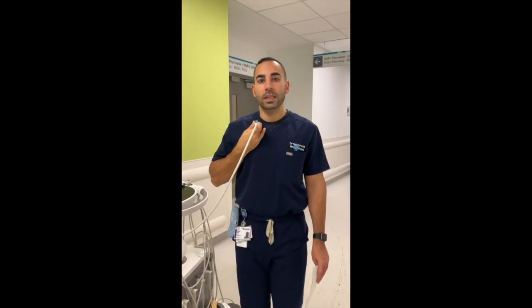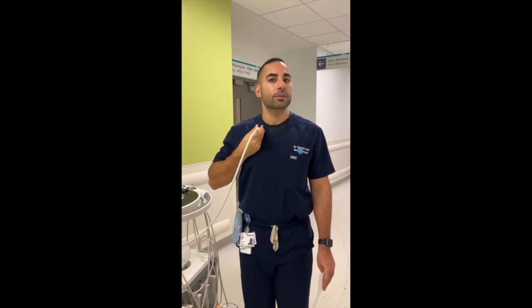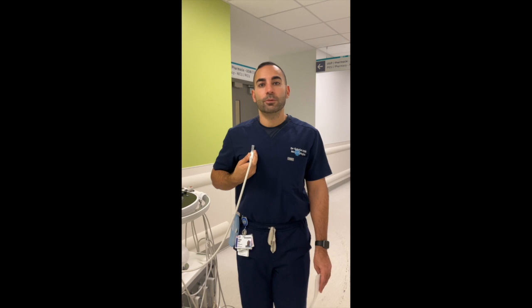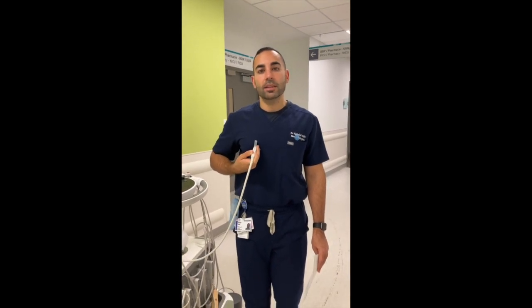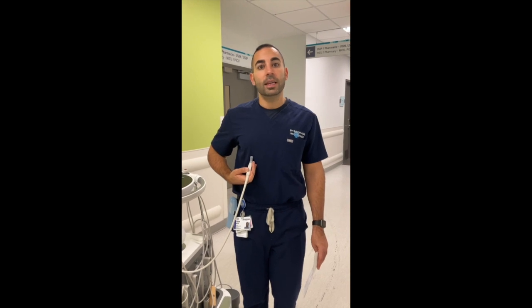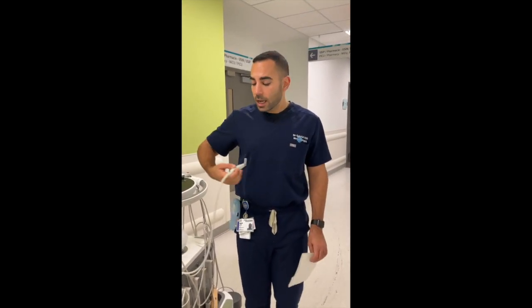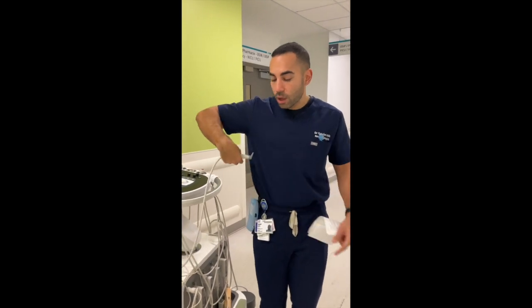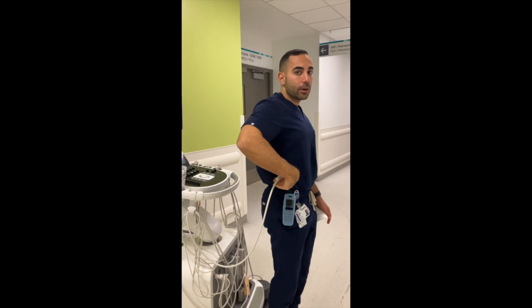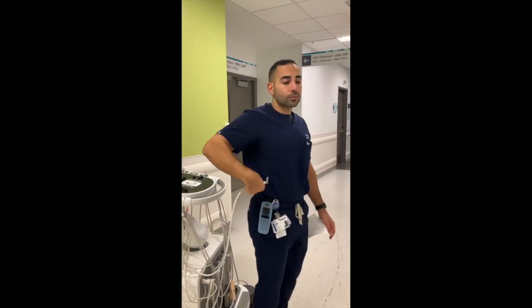When opening the actual images, you can start from the mid-clavicular line and drift down up to the nipple line. For the lower chest, you want to start at the nipple line and drift down up to the costal margin, where we see the diaphragmatic surface or interface with the lung. For the last view, the lateral, we start in the mid-axillary line and slide down to the diaphragmatic level that you will see on the chest ultrasound.